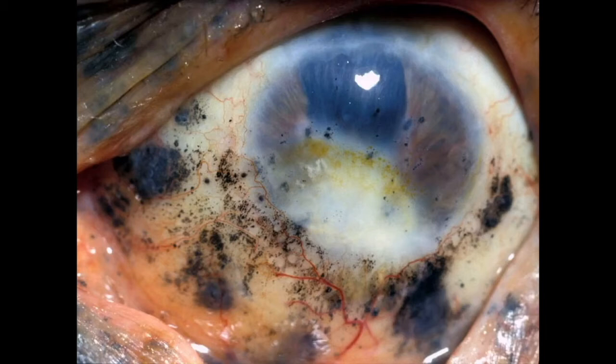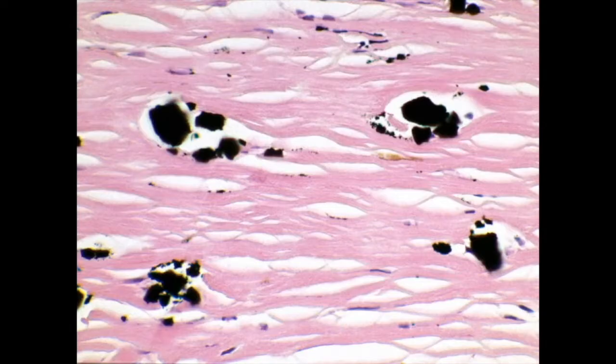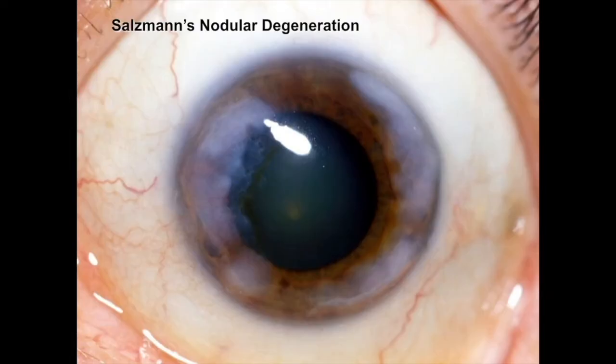The patient with the chronic actinic elastosis actually is the coal miner with the accidental tattooing that we saw previously. Histopathology of this penetrating keratoplasty specimen shows black particles of coal in the corneal stroma. No inflammation is noted. Salzmann's nodular degeneration. We see a fair number of cases of this recently. Essentially it is subepithelial fibrosis.